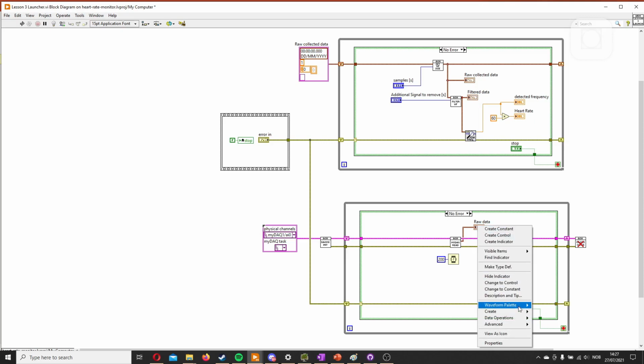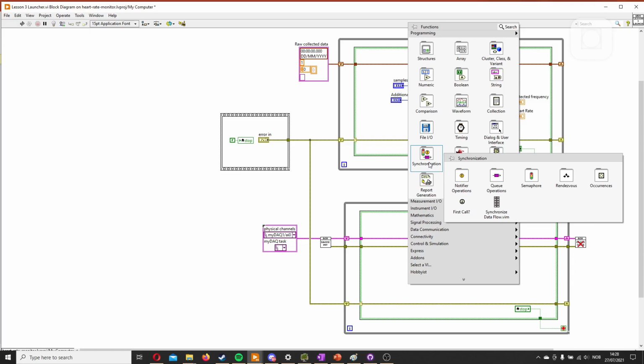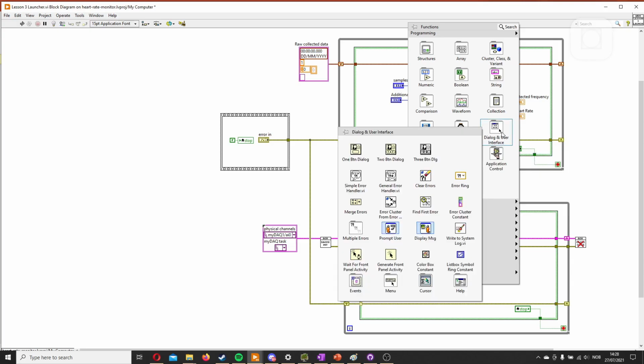The reason we don't just create a local variable here is because this raw data only holds the last data sent to it, which means we could lose some data if these run asynchronously, which we want them to do, and is the whole point of having two separate loops most of the time. And this is why that's not an option. What we need to do is put it in some sort of communication storage where the top loop here can read it at its own pace, making them unsynchronized but without losing any data. To do this, we will use a user event. You will not find it in the synchronize here, but instead you will find everything in the dialog and user interface here. Go into event, and then we'll pin this one.